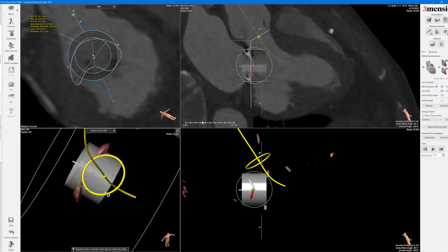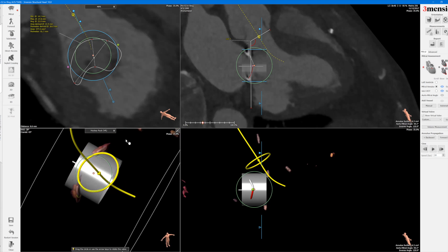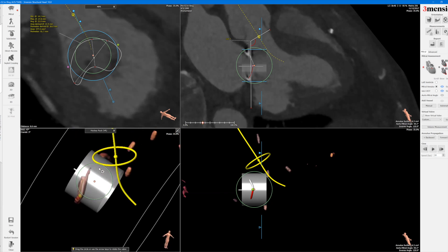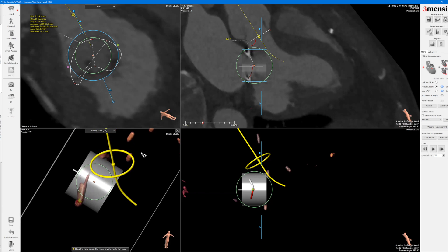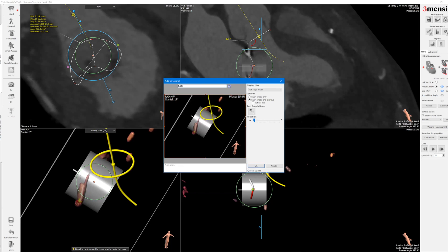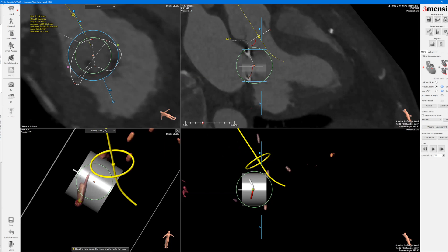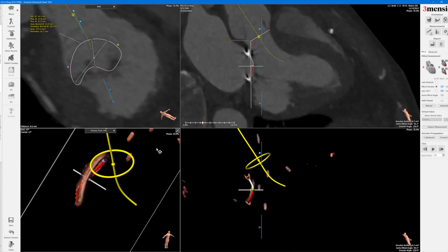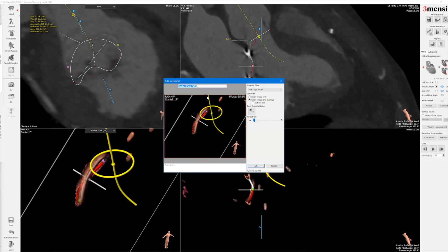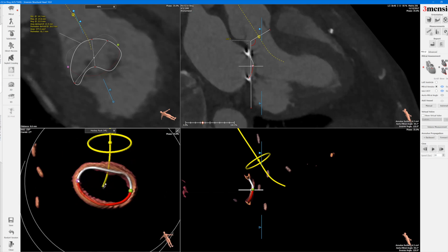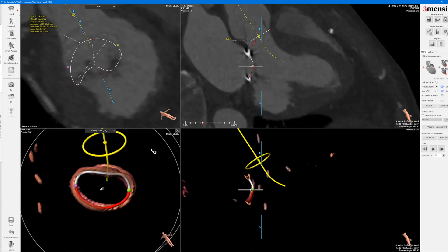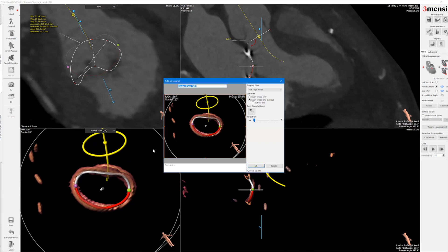You can certainly look at multiple different angles in terms of deployment and coaxiality. Take a picture of this RAO view, and you can even drop the valve and show how it might look on fluoro. You can also show how it looks on the en-face view just to illustrate the point.